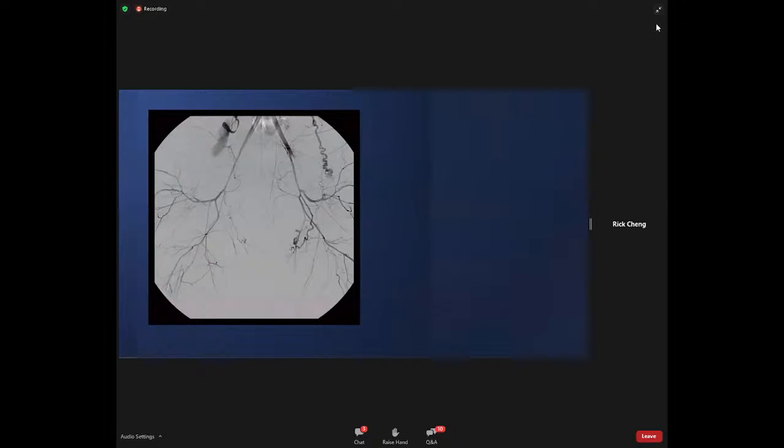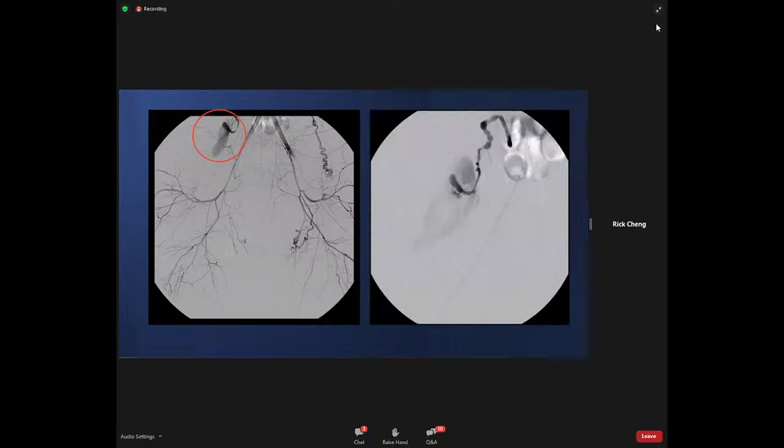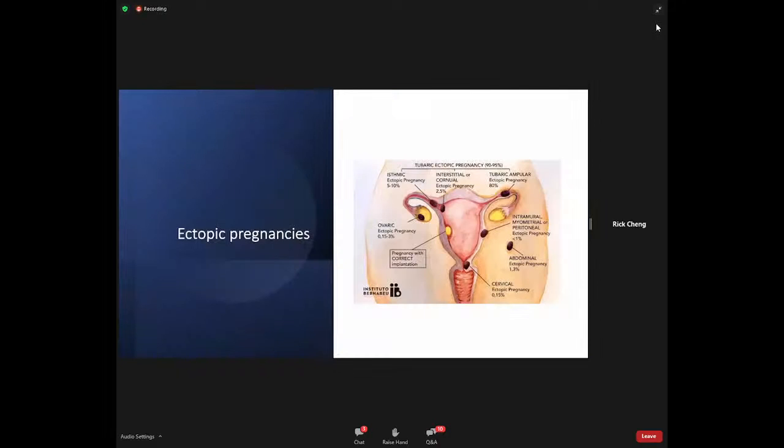On the initial angiogram, you can see that the patient is very intravascularly depleted, as the vessels are very small in caliber, including the uterine arteries. Interestingly, on the right ovarian artery, clearly there is a laceration with active extravasation. This was selectively catheterized, and glue was used to embolize this lacerated artery. She did well, subsequently stabilized, and was sent home after a couple of days.